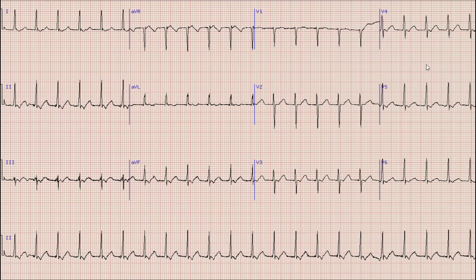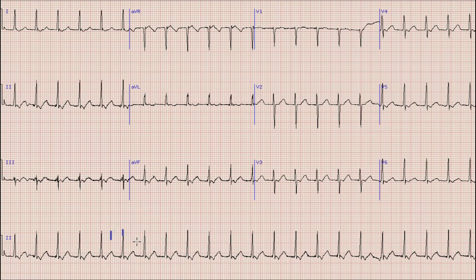Starting with the discussion: one prominent thing you can note on this ECG is the presence of tachycardia. The heart rate is around 140 to 150 beats per minute, so this means that this is a tachycardia.